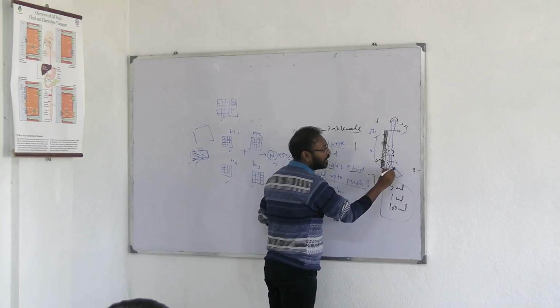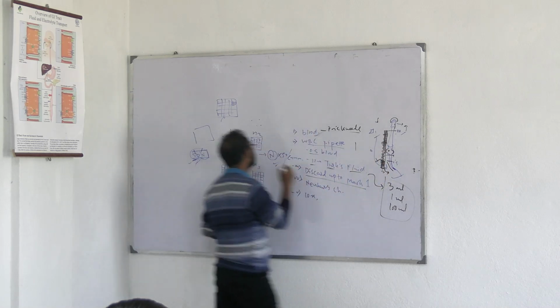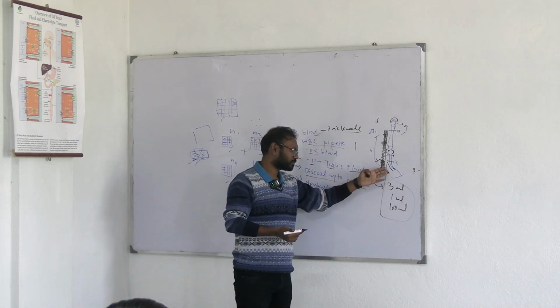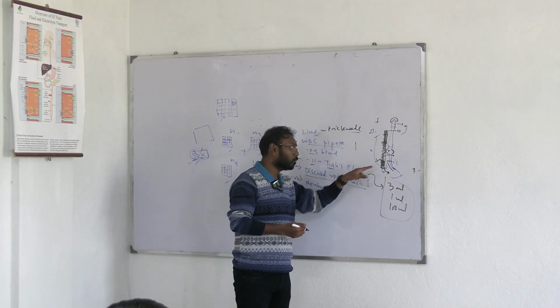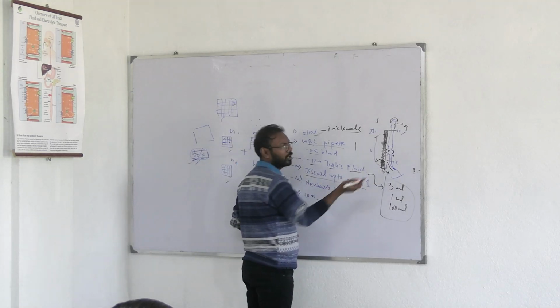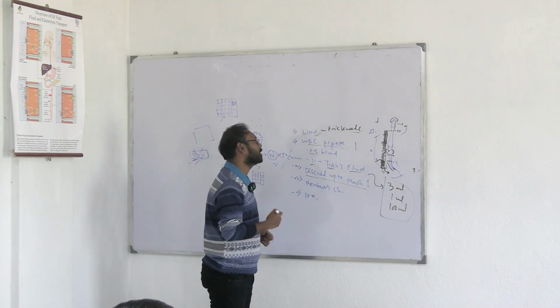If you put this fluid into the Neubauer chamber, you will see similarly lower values because of improper dilution. The blood will be more diluted, so you will get low values. To remove that bias, I made you understand on the previous day.